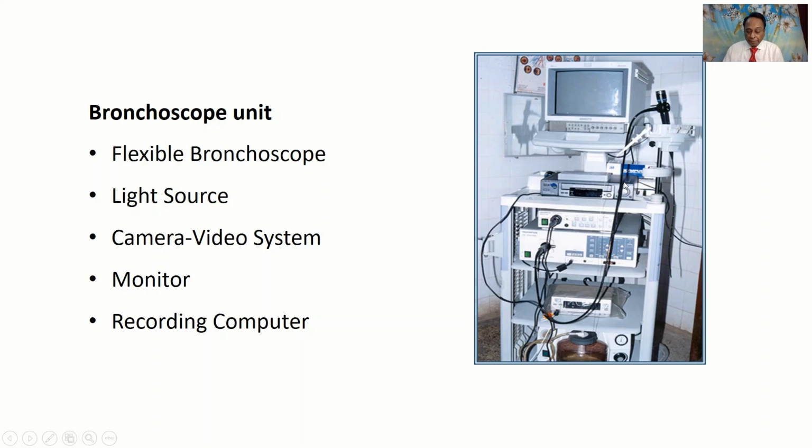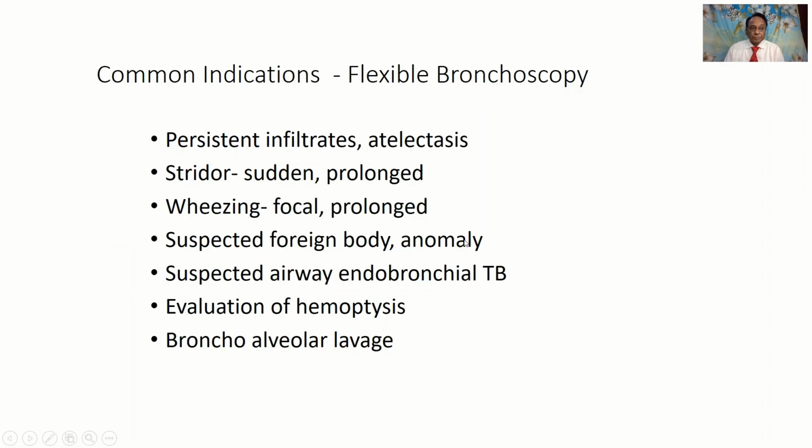That is always better. Otherwise sometimes people can misuse it. It should be properly kept in a room, and the bronchoscopes should be very nicely organized. If you want to do a bronchoscopy, the room should be very attractive to the children, with a lot of balloons or something like that. Then only they won't cry.